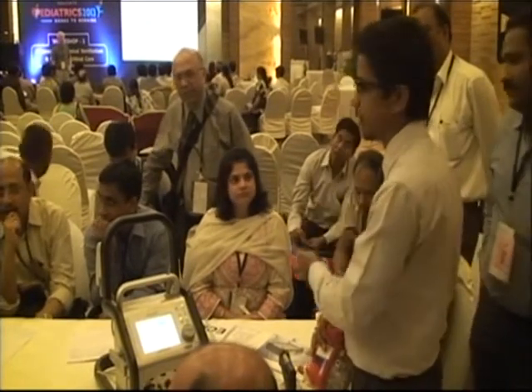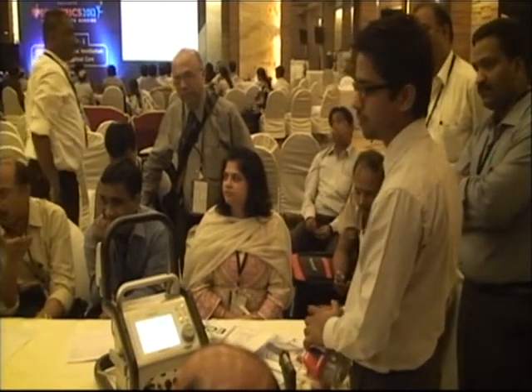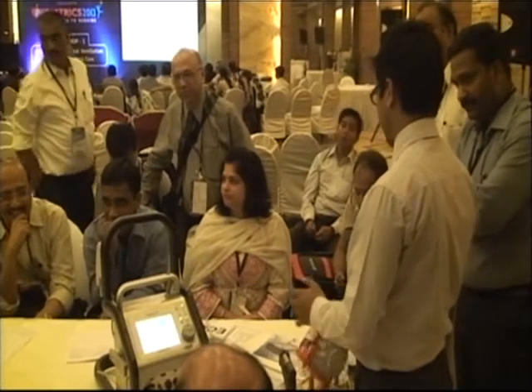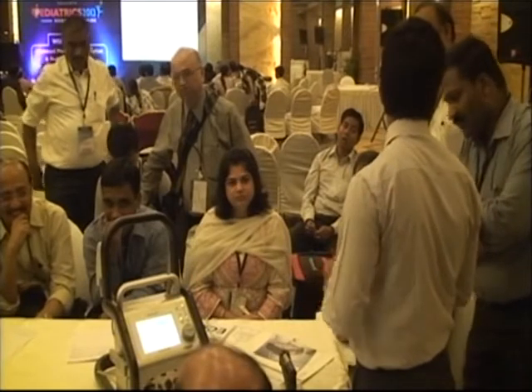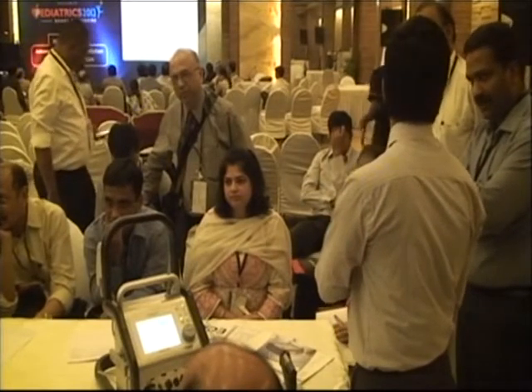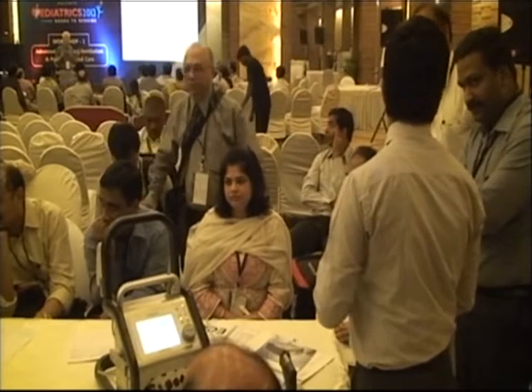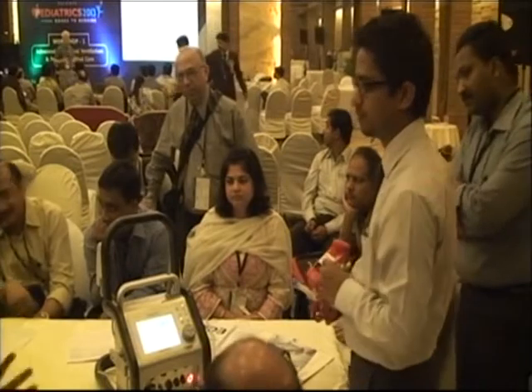oxygenated, but if you want, say if we have a patient who has gone into pre-renal failure because of his hypotension, because of his cardiac dysfunction, we put the patient on ECMO and he is still not getting his urine out. What we can do is add a hemoconcentrator to it. The hemoconcentrator will filter out urine, and slowly as the kidney recovers and starts filtering out urine, we can discontinue the use. So that additional facility is always allowable in that.